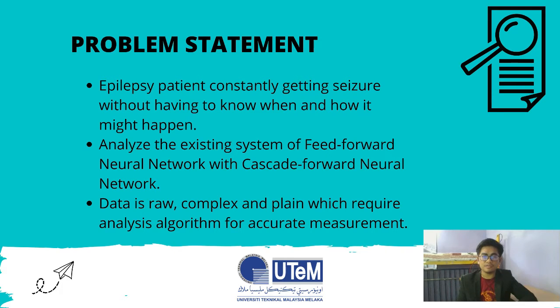Basically, neurophysiologists or neuroclinicians use visual inspection of EEG recordings for epilepsy identification. It will obstruct the diagnosis process and often takes several EEG recording sessions. Besides that, they need a system because of both the huge amount and the expanded use of long-term EEG records for effective neurological disease assessment and treatment of epilepsy.